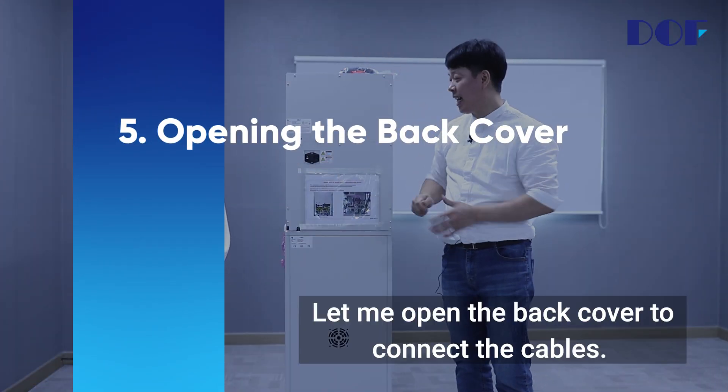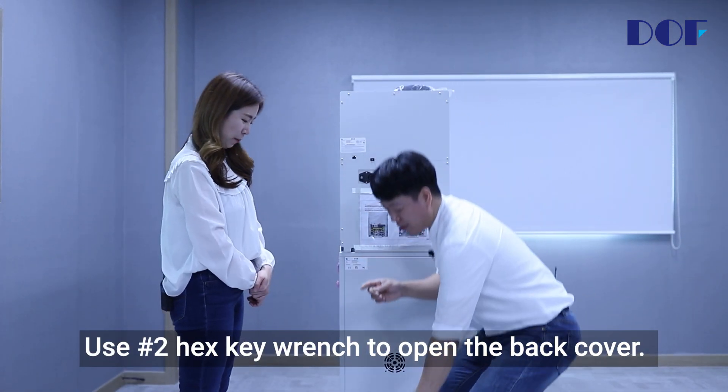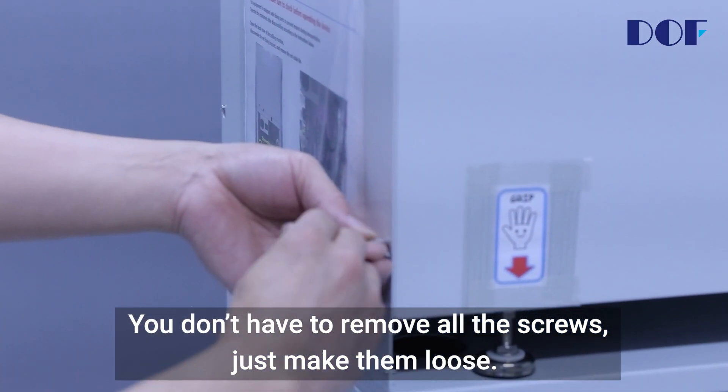Opening the back cover. Let me open the back cover to connect the cables. Use a number 2 hex key wrench to open the back cover. You don't have to remove all screws, just make them loose.